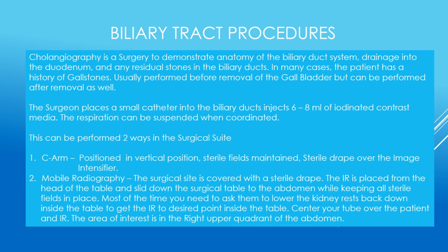Biliary tract procedures. Cholangiography is a surgery to demonstrate anatomy of the biliary duct system, drainage into the duodenum, and any residual stones in the biliary ducts. In many cases, the patient has a history of gallstones. It is usually performed before removal of the gallbladder, but can be performed after as well. The surgeon places a small catheter into the biliary ducts and injects 6 to 8 milliliters of iodinated contrast media. Respiration can be suspended when coordinated.